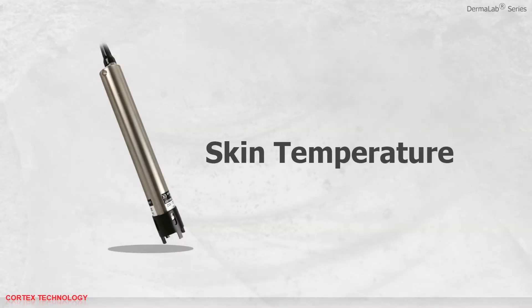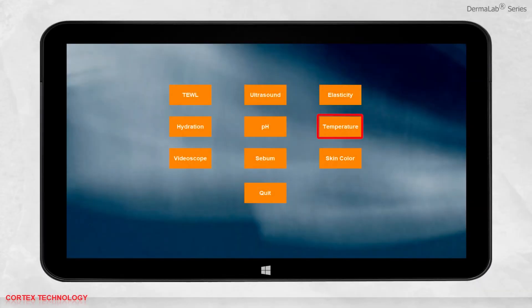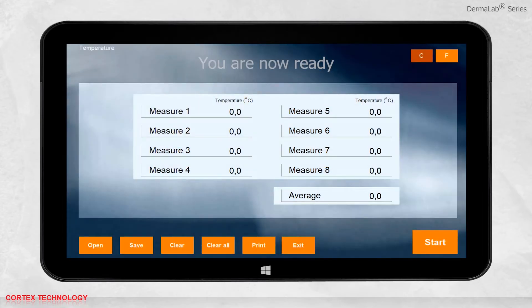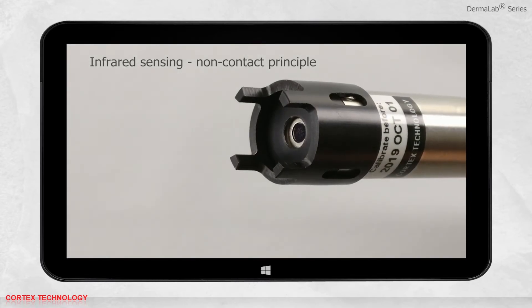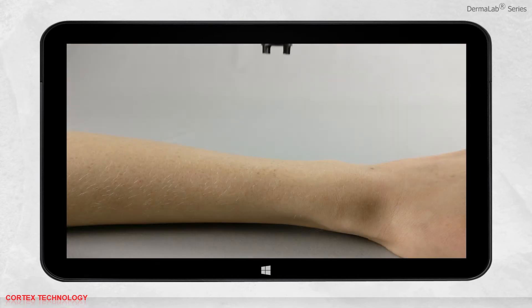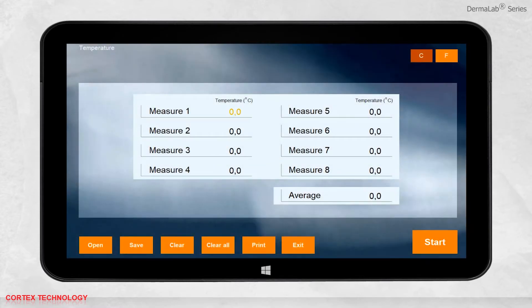Skin temperature application. Select temperature. You are now ready to make a measurement. The probe uses infrared sensing, which is a non-contact principle. Place the probe approximately one to three centimeters away from the skin and press start. After a successful measurement, you can see the temperature updating in the interface, and you can change the name of the measurement.